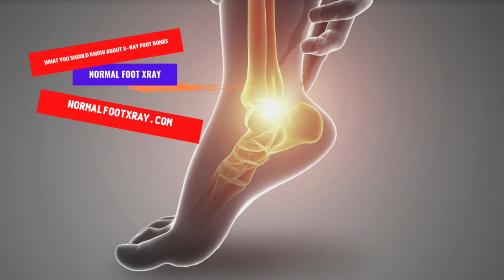The X-ray of the foot is an important diagnostic tool. It allows doctors to better understand the symptoms and structure of the foot. It also helps them to determine the correct treatment. Despite the various ramifications of a fracture, these rays can provide an accurate diagnosis and a better understanding of the underlying medical condition. The oblique view is often helpful in detecting a fracture.